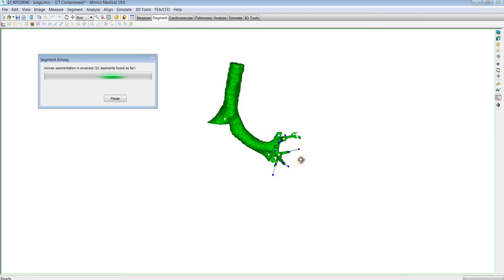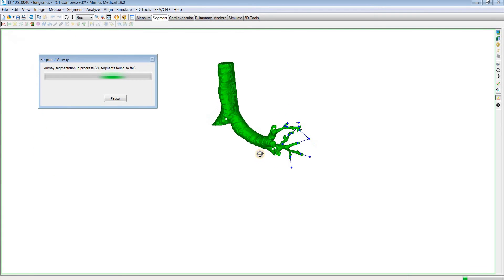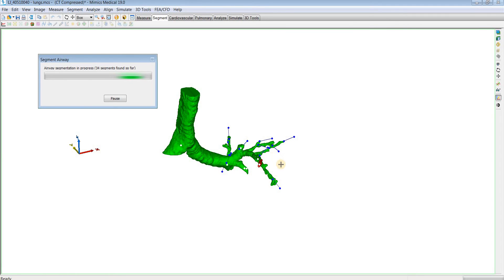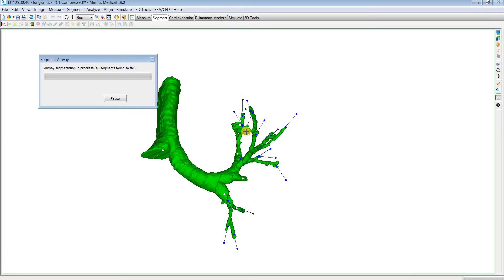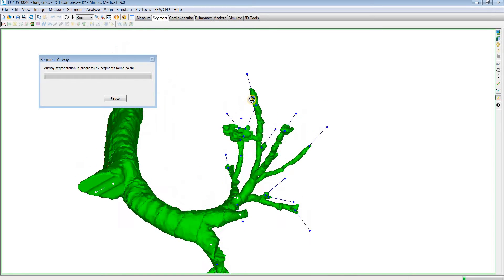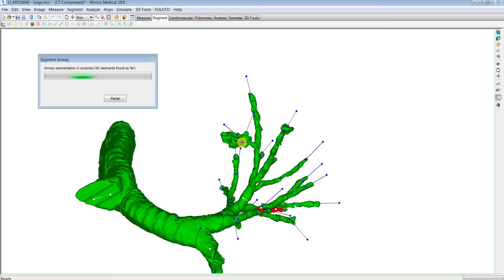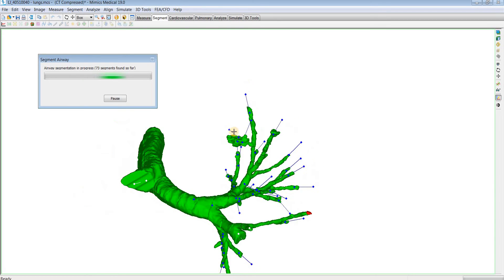While the segmentation is running, I'm going to rotate it around and try to see if any leakages do occur, and then just remember that spot. It looks like right there — that's probably a leakage, or what a leakage would look like. Once this is done calculating, I'll show you how to manually fix those.